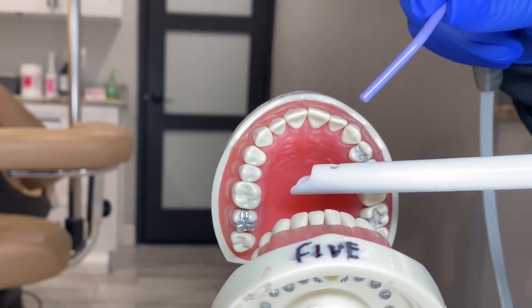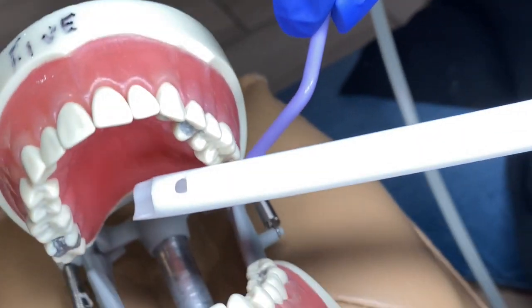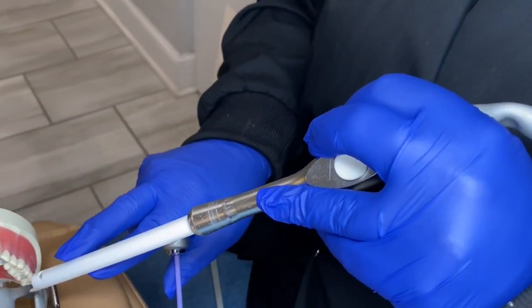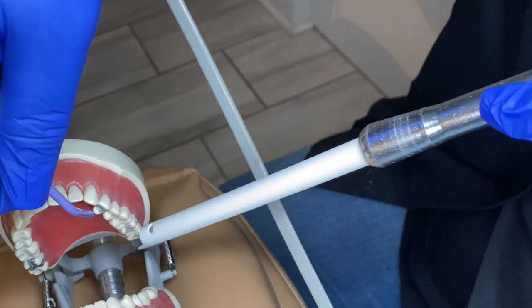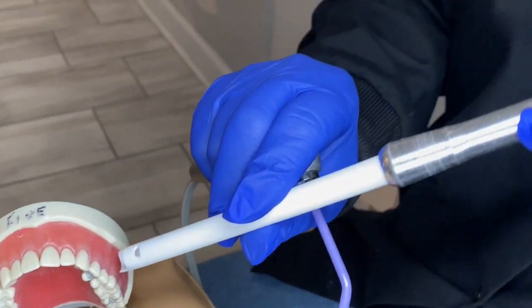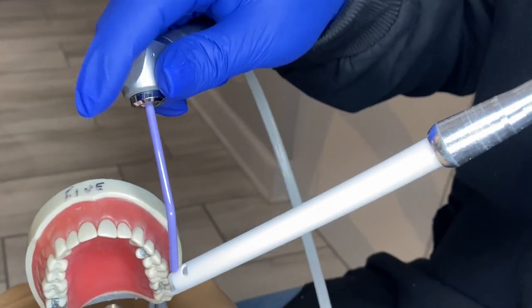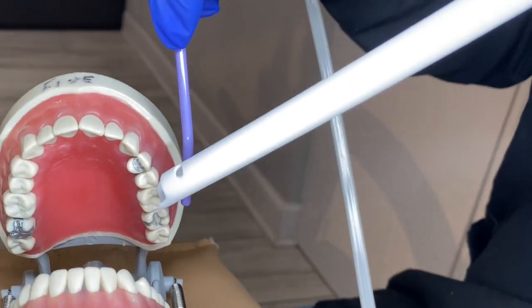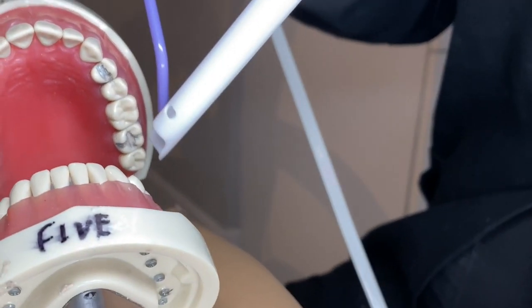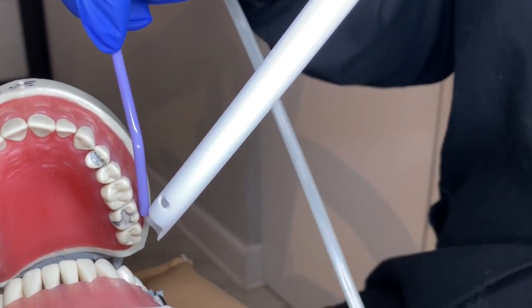Once you get to teeth 11, 12, 13, 14, 15, 16, you're going to have to come to the buccal occlusal side. The doctor is working lingual, occlusal, mesial, or distal — we're going to be on the buccal side where the cheek is. You could use your air water syringe to retract that cheek to catch that water. Water will always flow towards the back of the mouth, so we just follow towards the back.